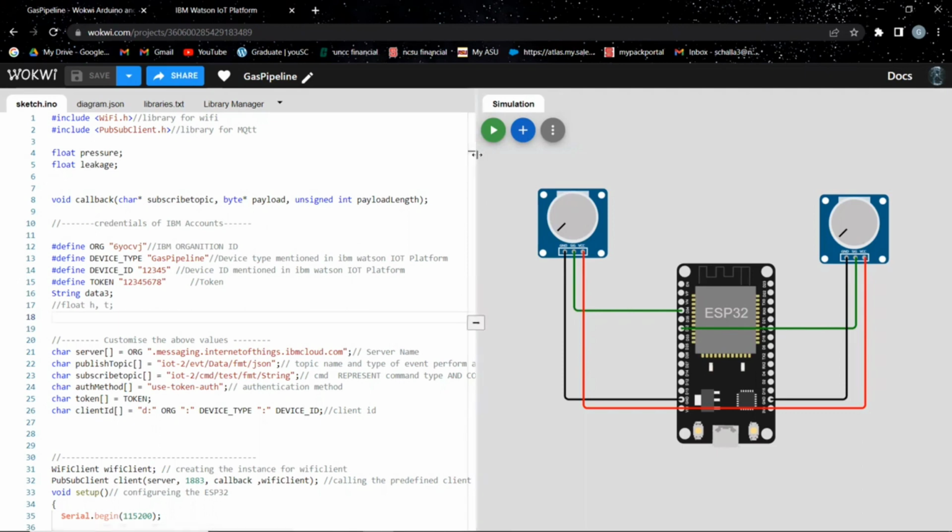Wokwi is an online interface which we use to simulate the IoT devices and also make connections between them. And we also code accordingly for the devices. This interface is divided into two panes. The left pane is used for the code part, and the right pane is used for the device part. So first, let's discuss the code part.